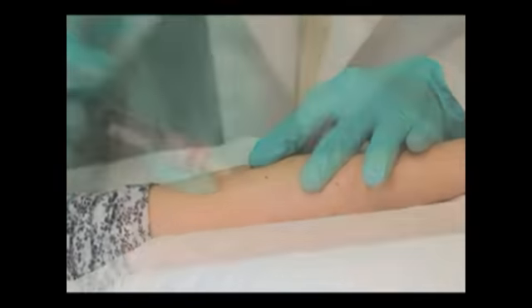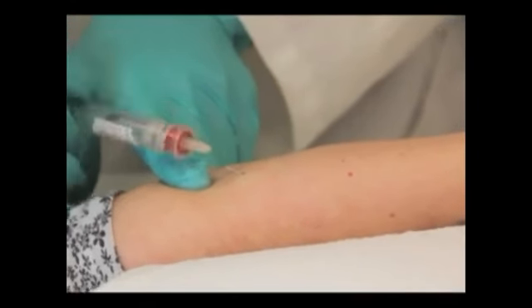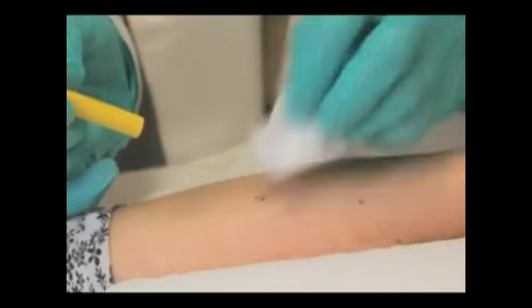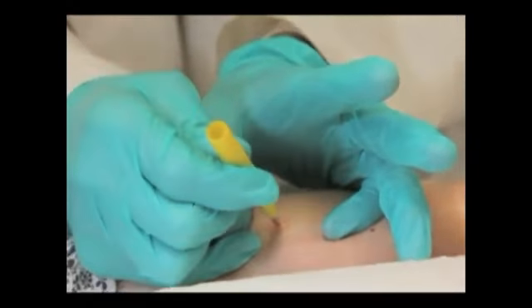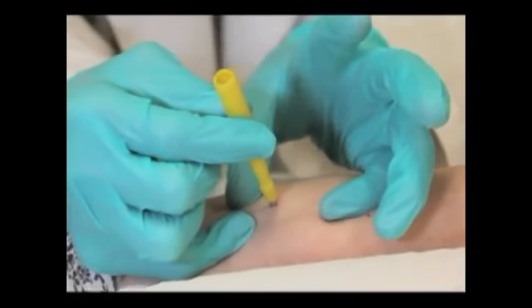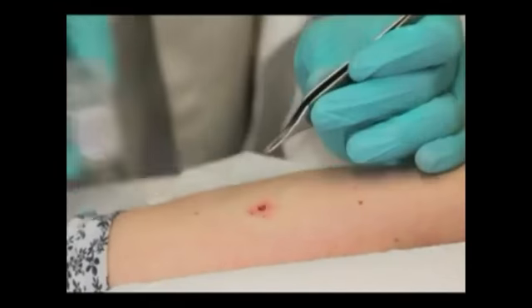A punch biopsy is a diagnostic tool that allows for histologic examination of skin conditions. We will first provide an overview of this procedure, followed by the indications and contraindications for the performance of a punch biopsy. We will then provide a step-by-step explanation and demonstration of a safe technique.